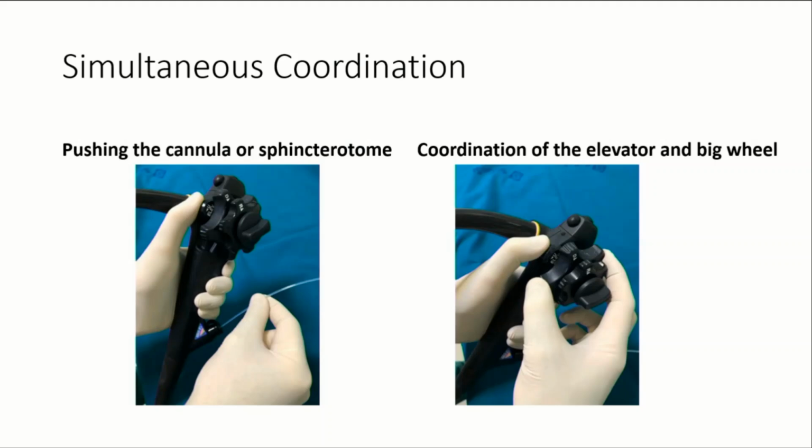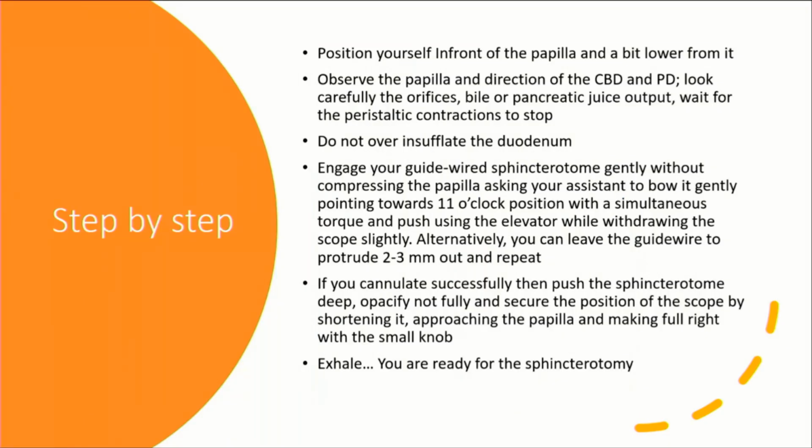Now, this is something that takes time: the simultaneous coordination of pushing the cannula, the sphincterotome, and at the same time coordinating with the elevator, which is here, and the big wheel. So this kind of maneuver takes some time to learn.